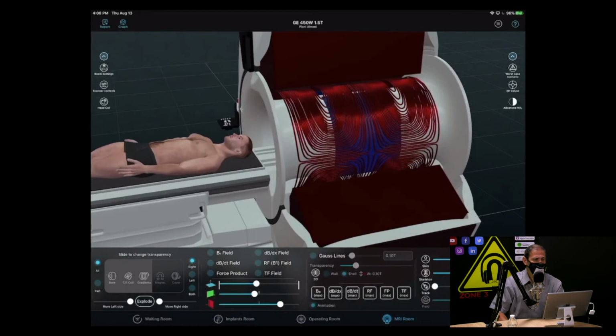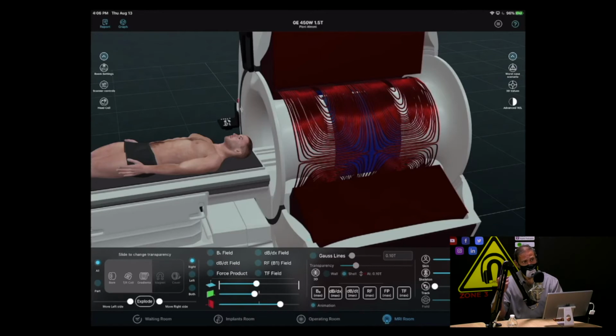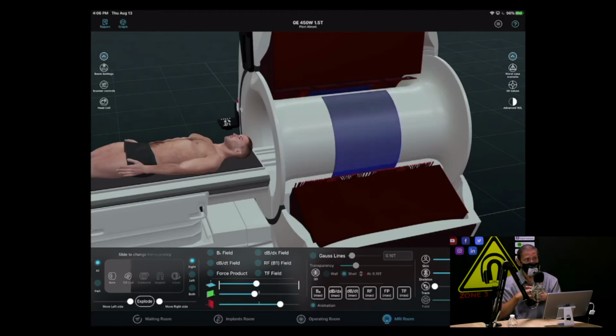Right. And for our audience that aren't as wise to the physics of MRI, it's the gradient coils that make most of the loud noises that you hear as a patient. The noise that we hear is coming from the gradients being activated and deactivated, turned on, reversed in the presence of a powerful magnetic field. That's correct. So one magnet in the presence of another suddenly appearing magnetic field, they try to align relative to this powerful field, and that's the torque. What you're hearing is the vibration as we do that tens of thousands of times per second.